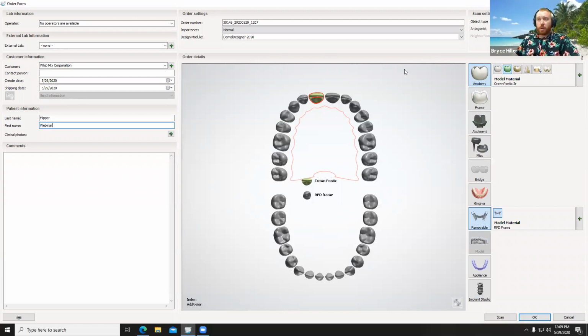I'd probably tend to agree with you. I mean, you could certainly try it. From an FDA standpoint, the Crown and Bridge material is approved for intraoral use up to 30 days. If it's a flipper, theoretically a flipper should be pretty temporary anyway. So if you're going to be within 30 days, try it in the Crown and Bridge material. Realistically, either is probably going to work.